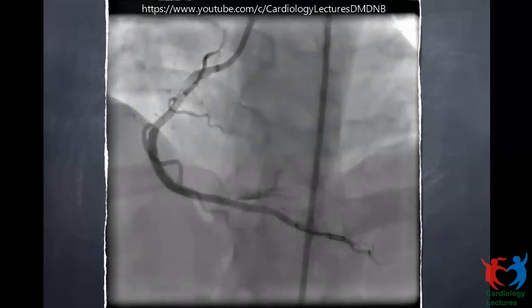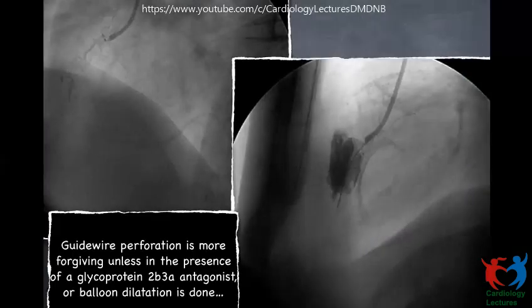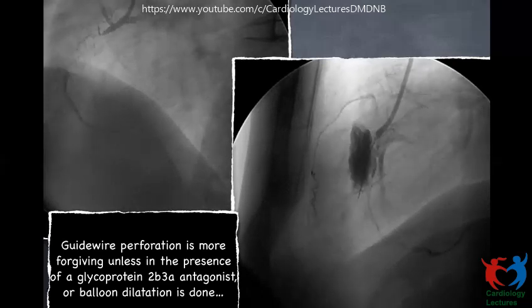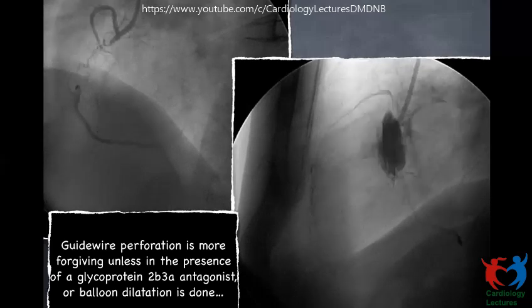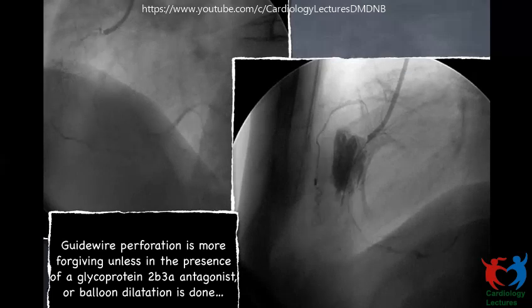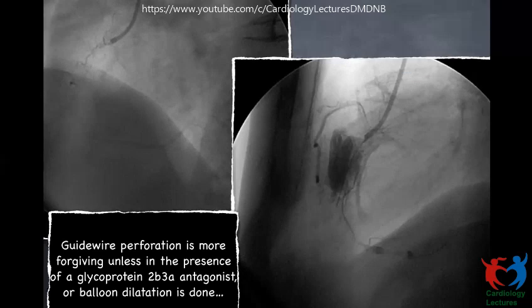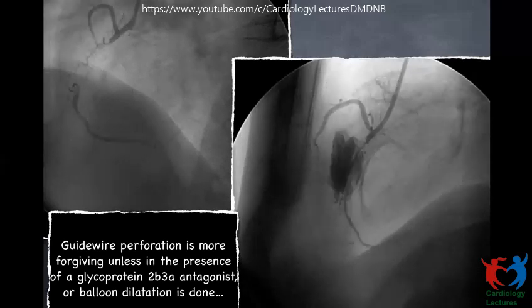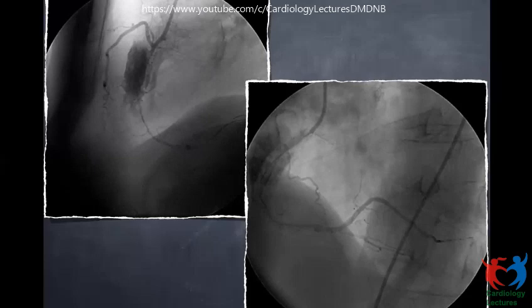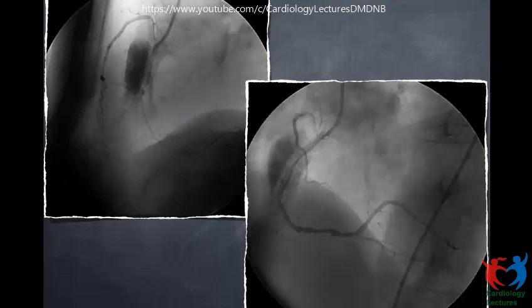Make sure that when you have the wire inside the vessel, it shouldn't be in a smaller branch. In another patient with a proximal CTO and bridging collaterals, we tried crossing with a Crossit 200 wire which went outside the vessel. One can be reassured if the patient is not on a glycoprotein 2B-3A receptor blocker and you do not balloon dilate — you are unlikely to have cardiac tamponade. So we kept the wire in the pericardium, crossed the lesion with a different wire, stented it, and then pulled out the first wire.